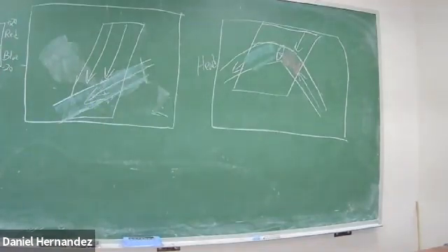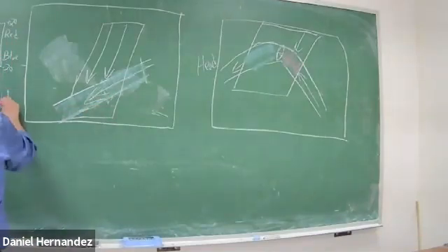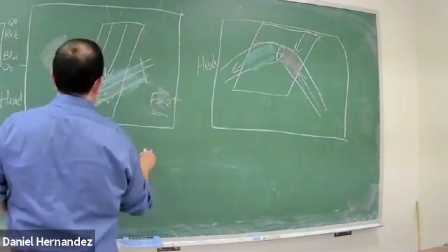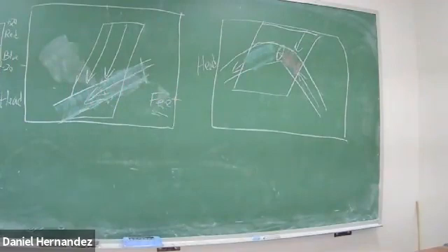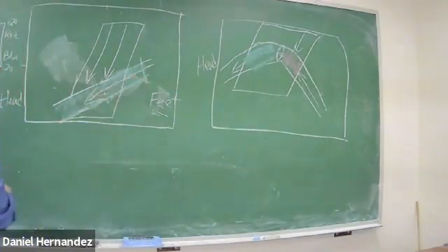So that's why it's important to look at what you have your scale set up at. When you look at your color chart over here, when they give you an image on the test, is a positive Doppler shift red or is a positive Doppler shift blue? If they give you this on the test and you knew that this was your head and this was your feet on that side, you would be able to tell that even though this vessel was blue, the flow direction was still towards the head. It's still antegrade, it's still cephalad flow.